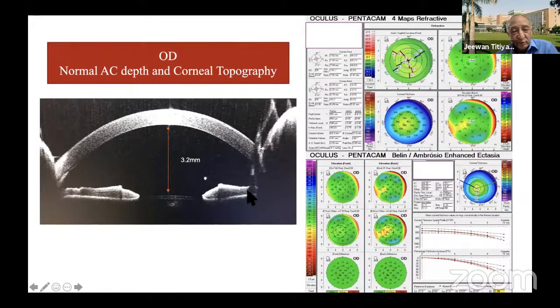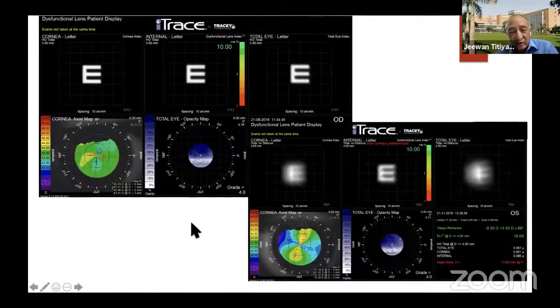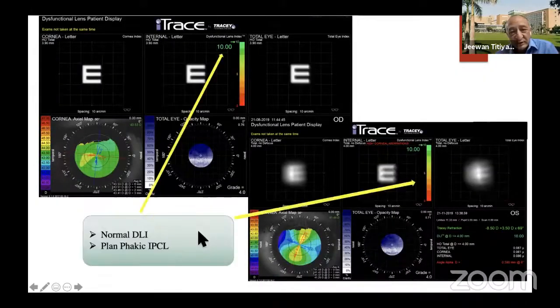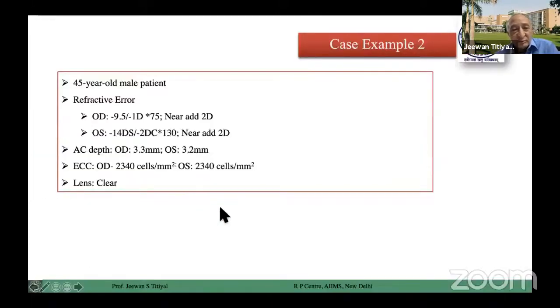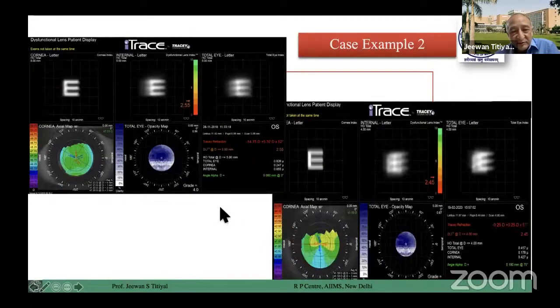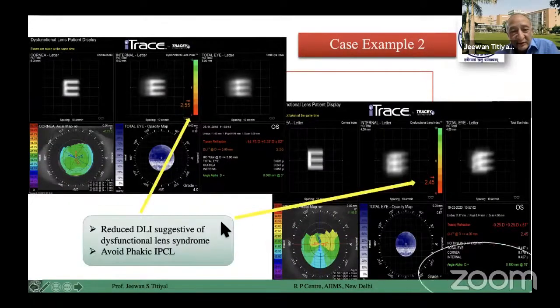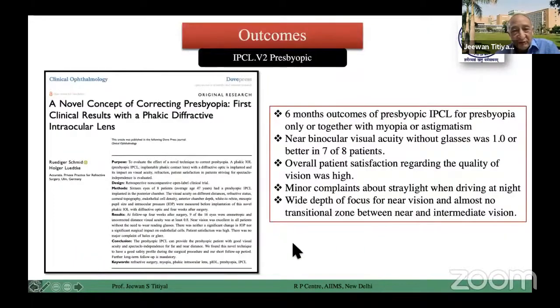I do OCT for all patients to look at the angle area also. Topography is normal in both eyes. And DLI is also normal — a very suitable case. DLI is an important part of all examinations for presbyopic phakic IOL patients. This is another patient — you can see more internal aberration and DLI is also poor. So this patient may not be a suitable case for presbyopic phakic IOL.